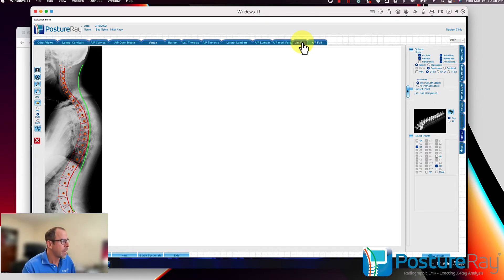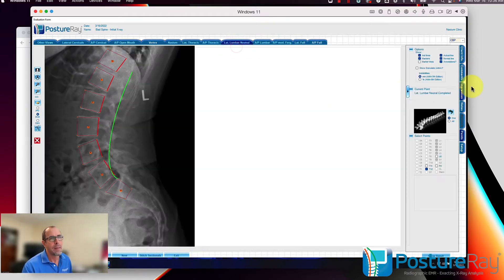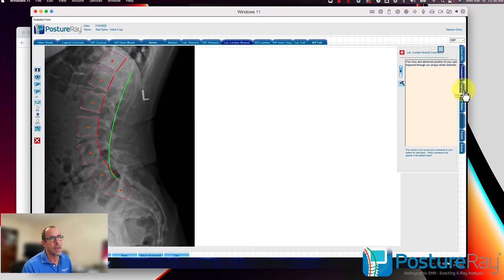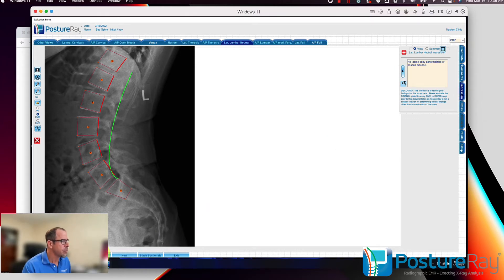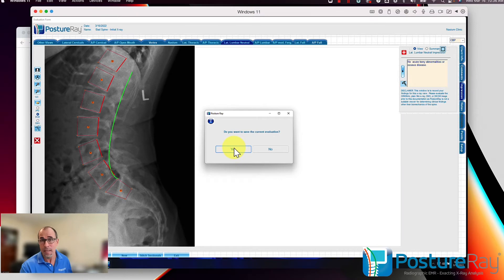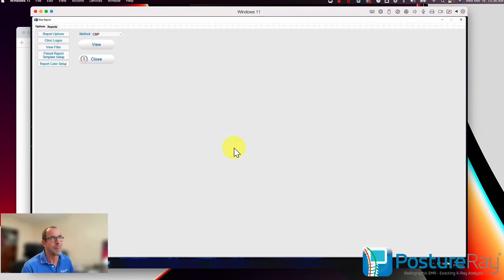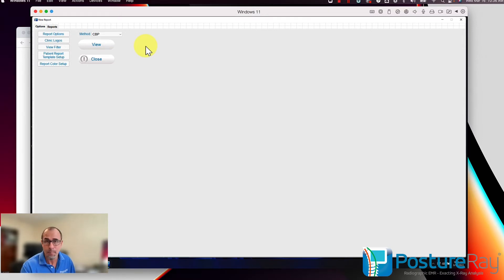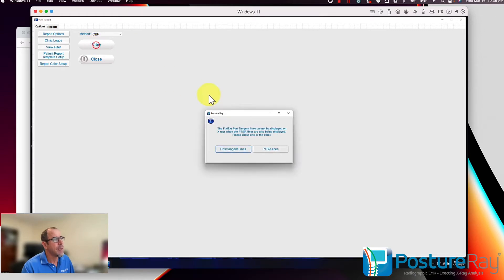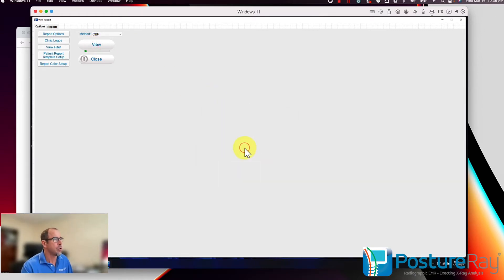Once those are done, all we have to do is come in and — after we've put in all our notes — go into the lateral lumbar, and then we have the impression as well. If I want to generate a report, I can go ahead and generate it as a PDF. You can totally customize this with your logos and colors. The text itself you cannot customize, but the actual look, feel, and branding, you can.